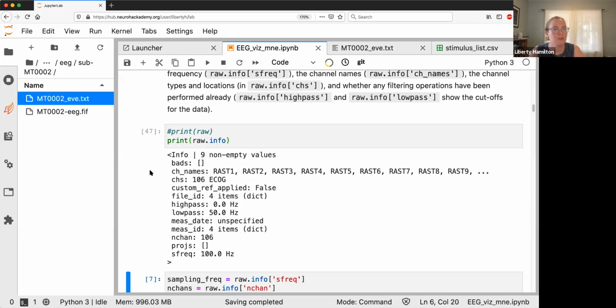I think you can project to a standard template, but there are so many assumptions that go into that, that if you were trying to make a claim about spatial localization that was not coarse, I'm not sure I personally would believe it. But I will say I'm not an expert in those inverse models, which is what you would do for that.